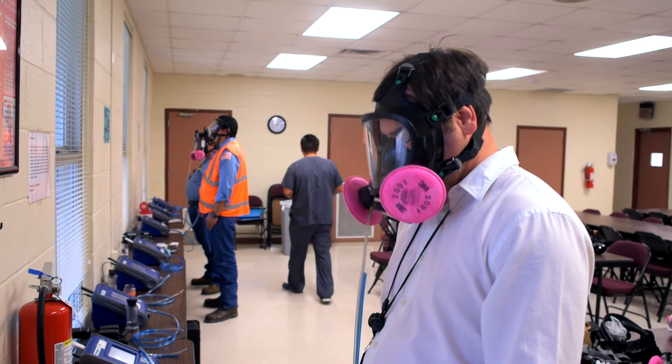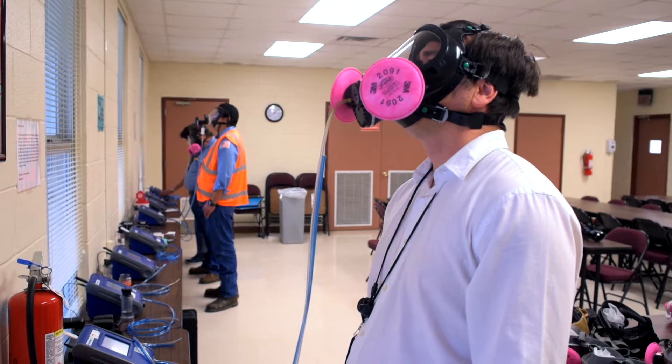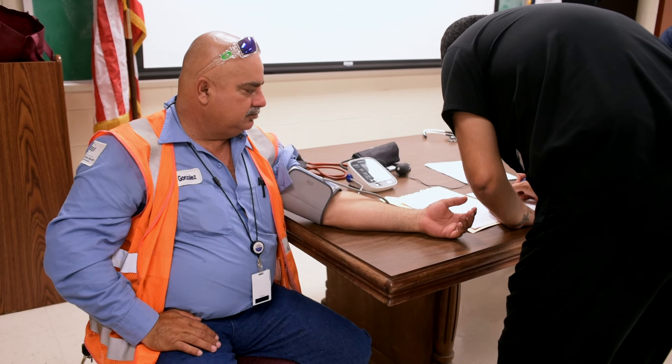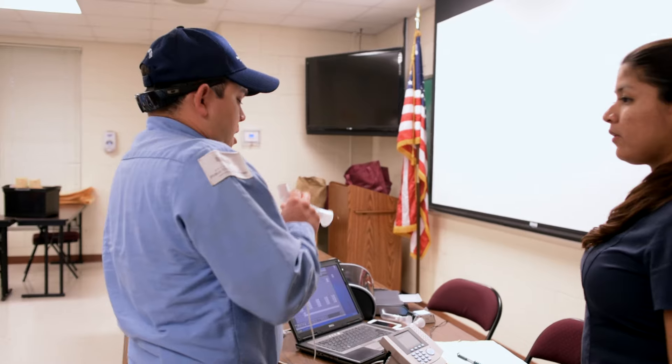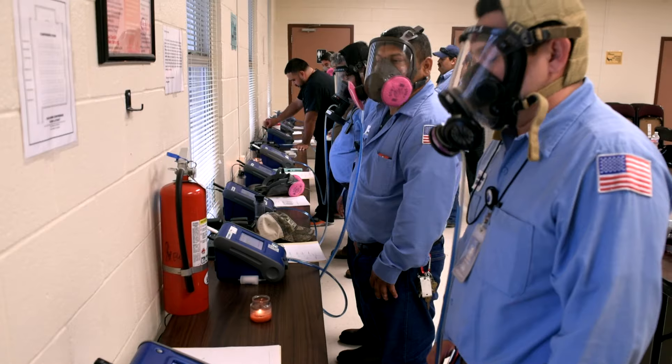After all the steps, if the seal is not broken, that mask is properly fit. The whole process takes a few minutes for each respirator, but the time it takes is well worth it to ensure the safety of all workers who must wear this protective equipment.